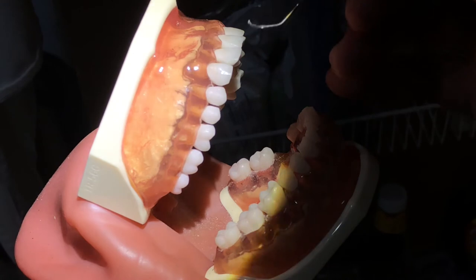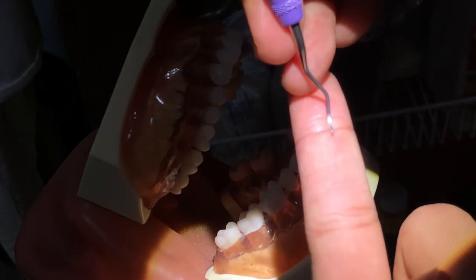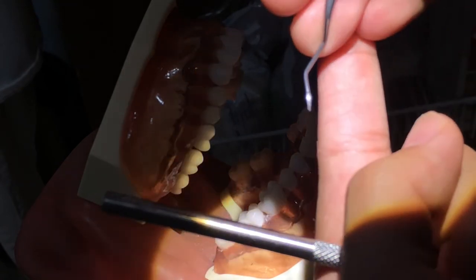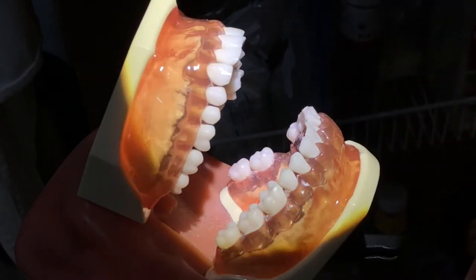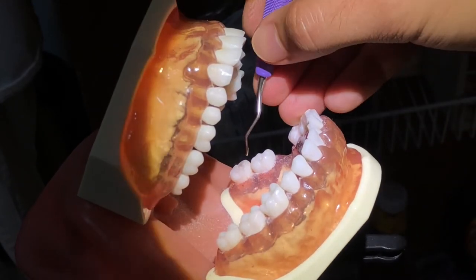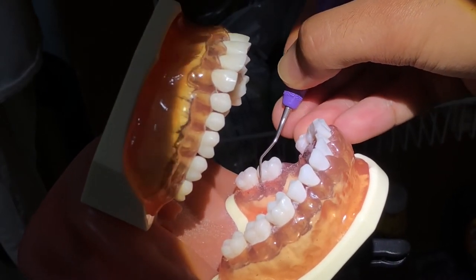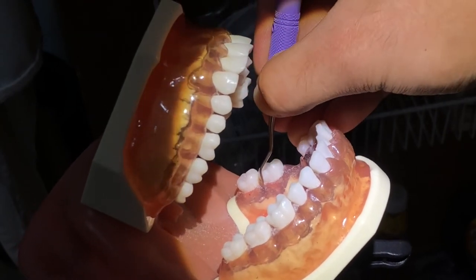Using a Gracey 13-14, I'll be instrumenting the distal lingual of number 18 to determine the right working edge. So first I'm going to close the blade and insert it, and then open the blade and activate.